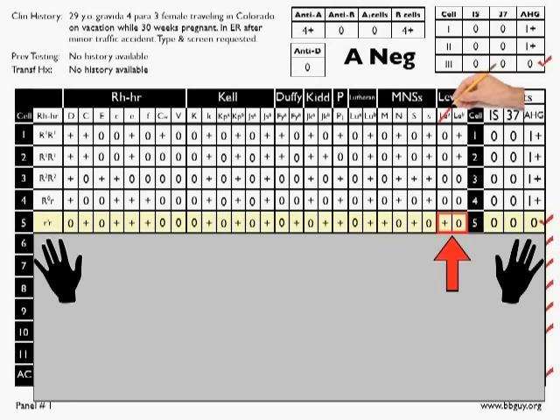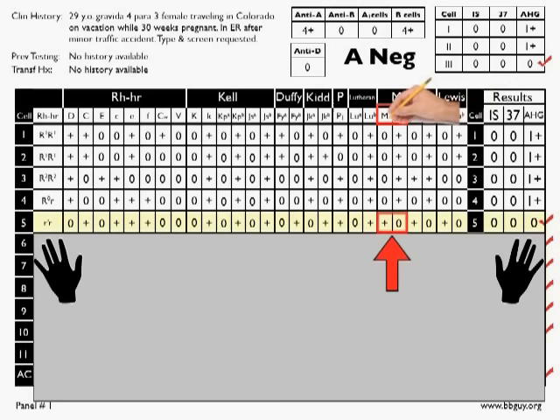Moving on to big S and little s, please note, this is in the MNS system, but we only want to focus on the pair big S and little s. So let's look at that, and we see that again, we have double dose expression of big S. Our pencil comes over, we mark a single slash through the big S. Moving on to the next pair, which is M and N. Again, same thing, we want to keep it with antigenic pairs, or pairs that go together in the same genetic site. Again, double dose expression of M, pencil comes over, make a single slash through M.